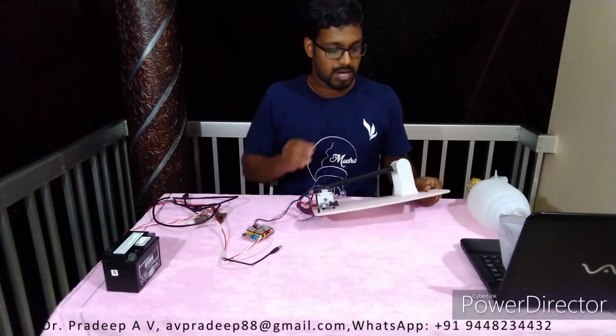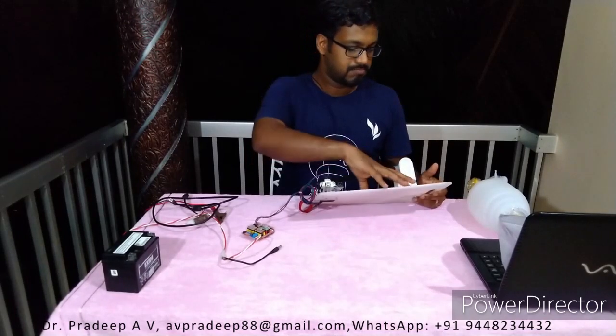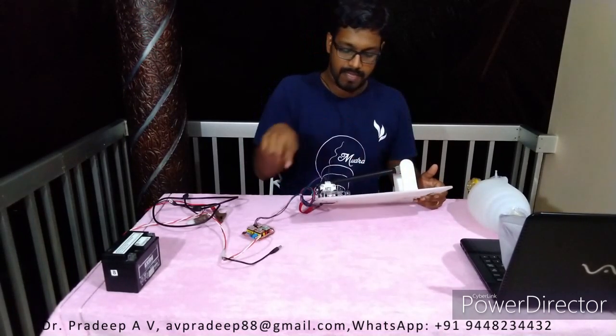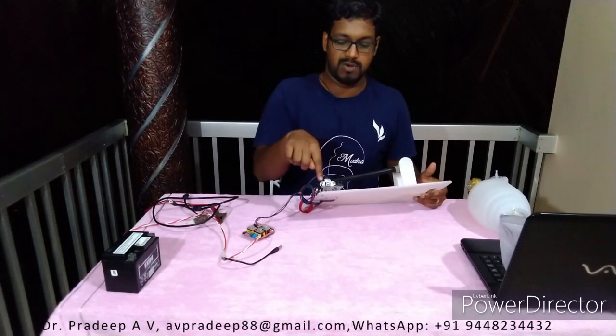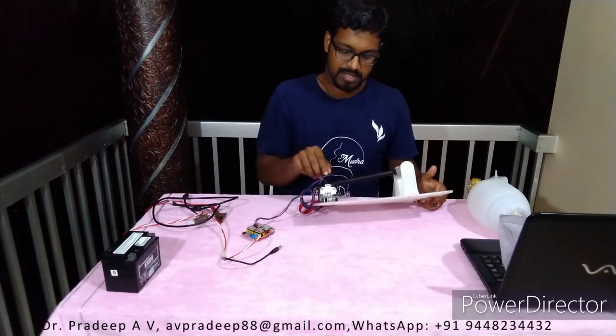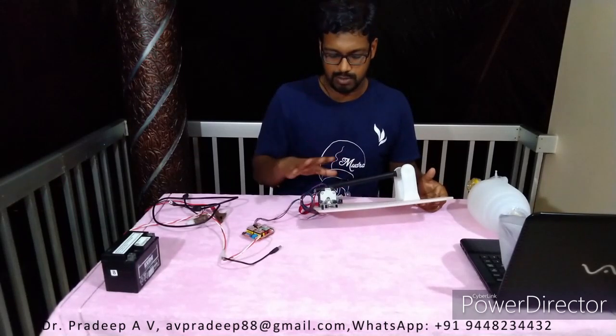So I used a vegetable cutting board. I have made a couple of holes: there are three holes to mount the Arduino, and four holes to just connect the stepper motor here. So I use a normal cable tie. This is a quick setup.